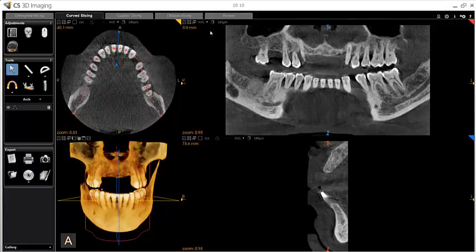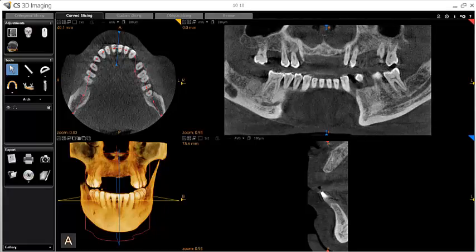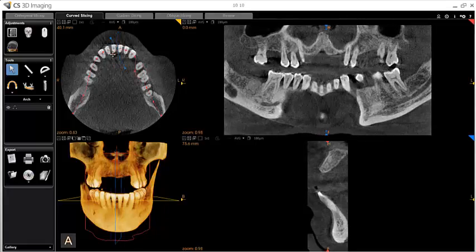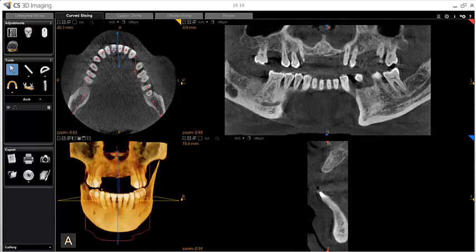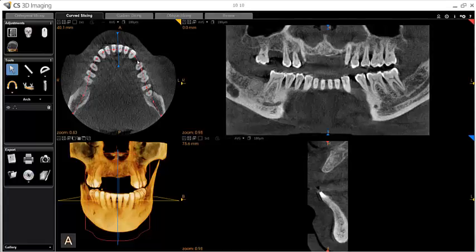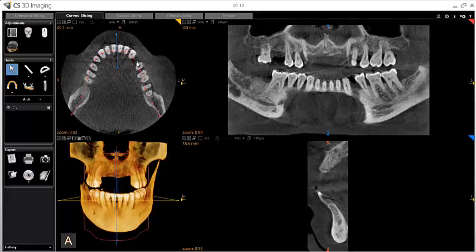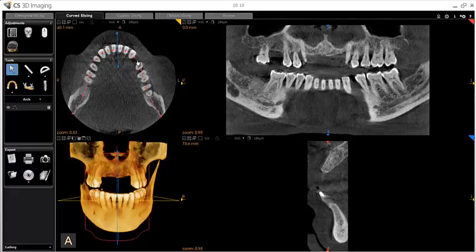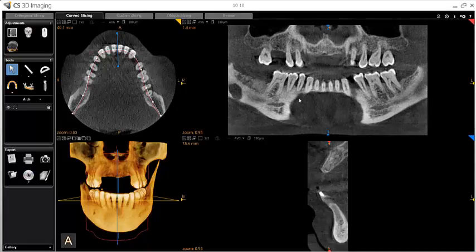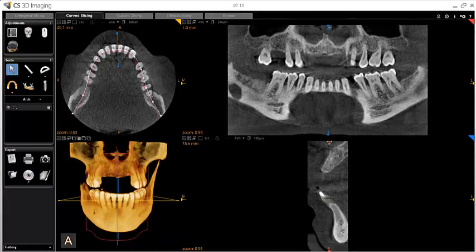To adjust the arch curve, you can click and drag either the control points of the curve or the red line of the curve. You can also move the curve facially or lingually using the scroll wheel on the mouse or the red movement handle in the transaxial view.